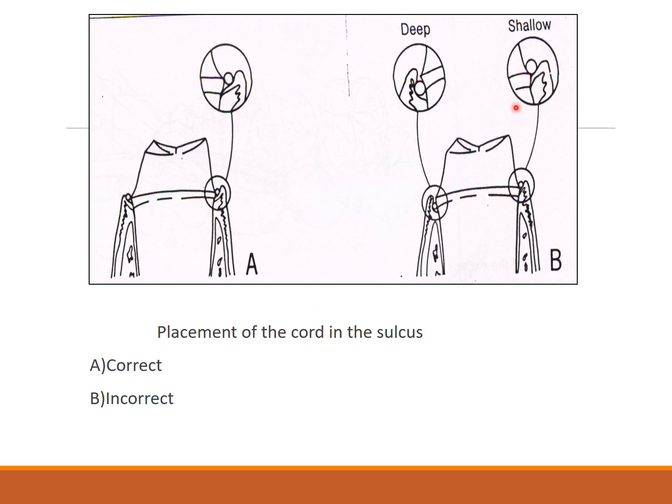So you cannot place the cord so shallow. It has to be a little deep. So this is the correct placement. This is the incorrect placement. This is the incorrect placement. You can just compare.